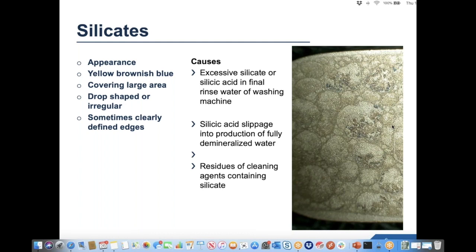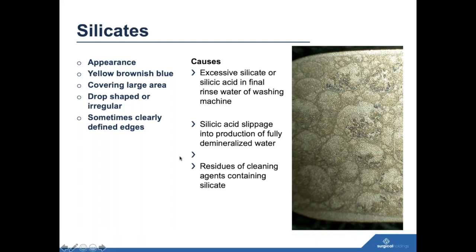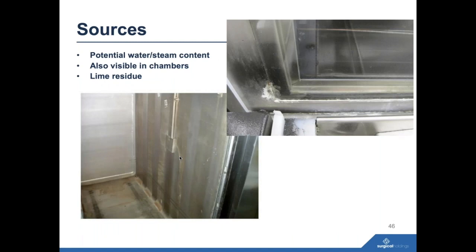Yeah, I tell folks all the time, the instruments, they're ugly, but they're okay to use. They want to send them out and have them refurbished as soon as they can, because like you said, it could make it difficult to determine whether it's a silicate stain or true bioburden that has remained on the instrument. Yeah, and in the case of the example I gave, they thought that was actually a feature of the instrument. They are obviously extremely stained, but they can give that almost rainbow visual.